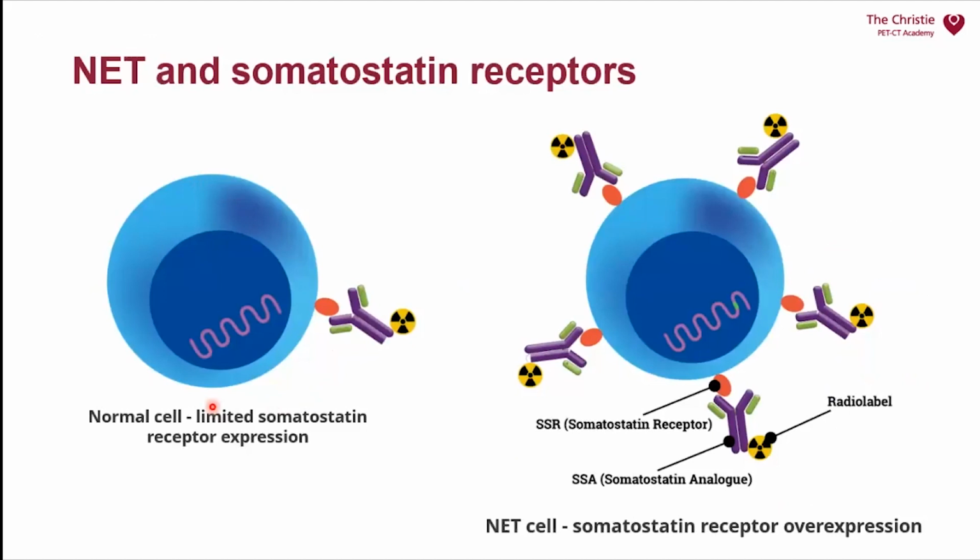This is just to quickly show that there's more of these receptors on tumor cells than on normal cells, which is why you get accumulation of the radioactive substance and why you get the signal that you detect with the scanner.